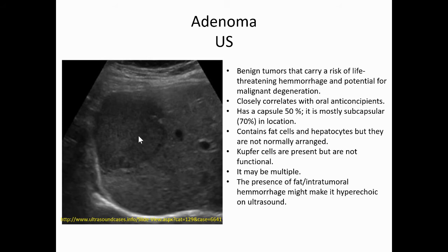make a sound diagnosis on ultrasound. Ultrasound is more like a screening tool. So you perform the ultrasound, you see a lesion, and then you tell the patient not to worry because ultrasound is not histology, but before histology we can perform further imaging with CT and MR, and that can get us closer to the final diagnosis. But ultrasound seldom gets us close to the final diagnosis.